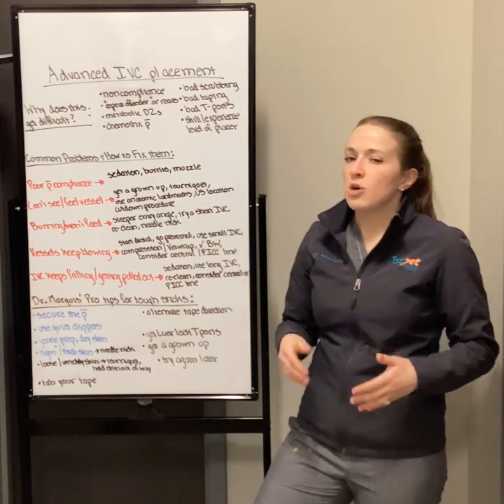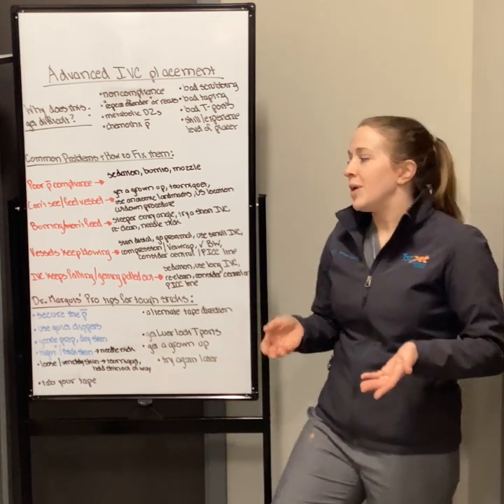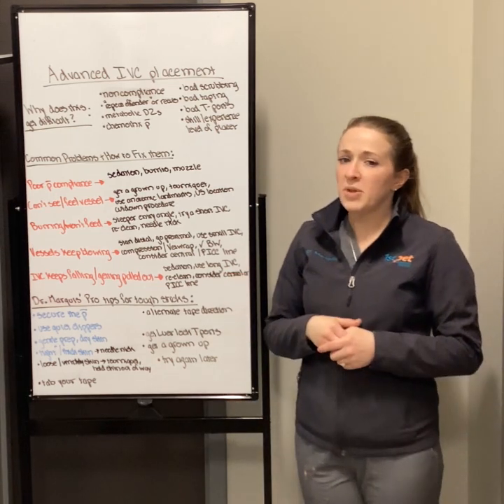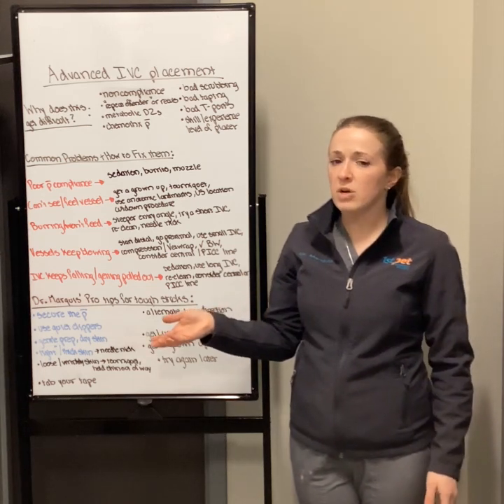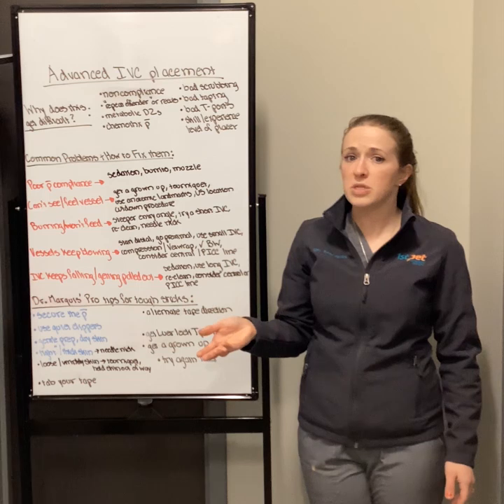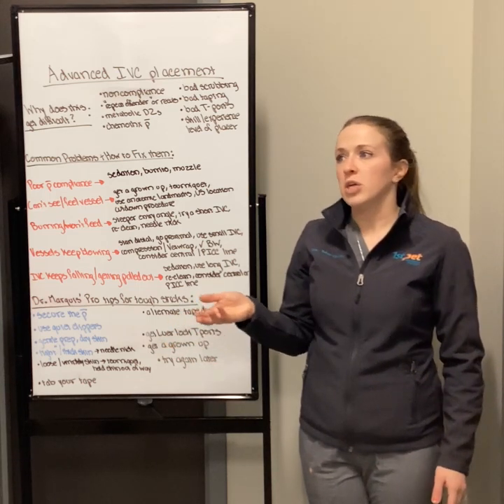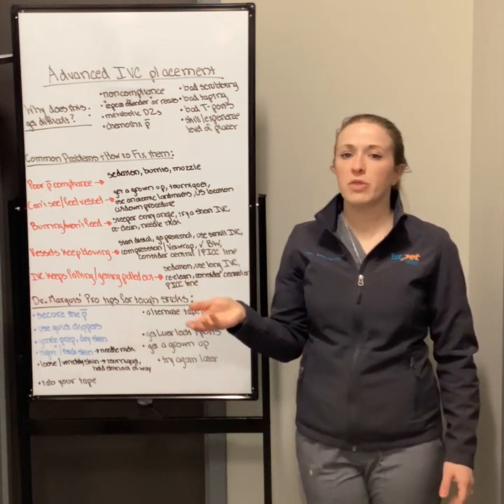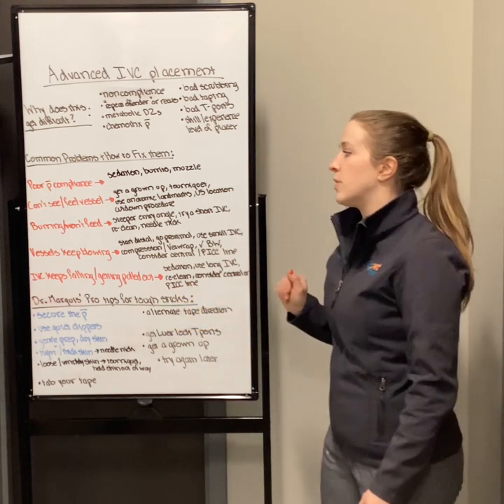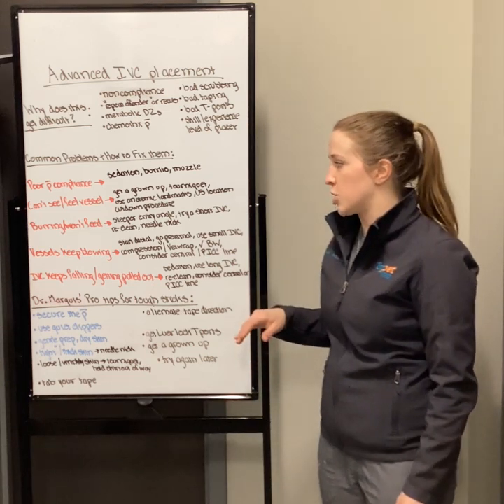Get a grown up. I know this sounds kind of dismissive, but it means exactly that. Even if you're really good at catheter placement, sometimes it's not going to be your day, and it's much better in that scenario to get the most experienced person in the hospital involved, whether that's a hospitalist, a specialist, another technician, an assistant that you work with. Get someone who you feel is going to help you get the job done. There's absolutely no shame in asking for help in that situation.